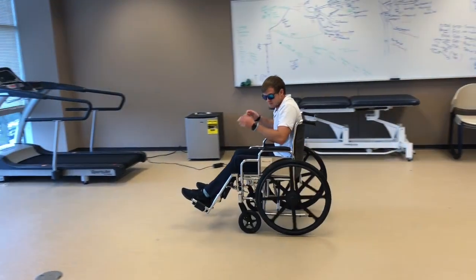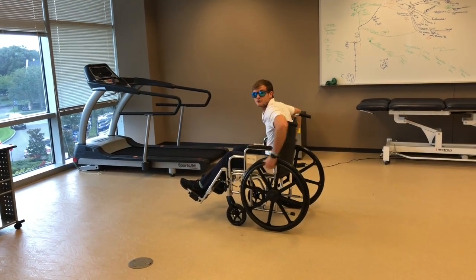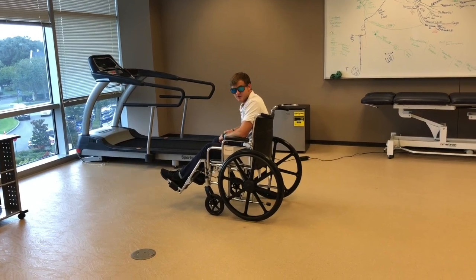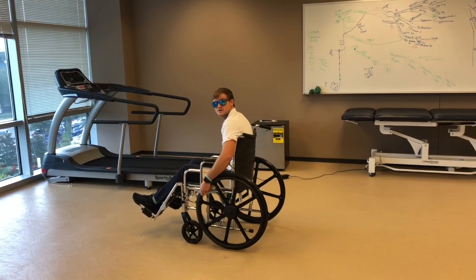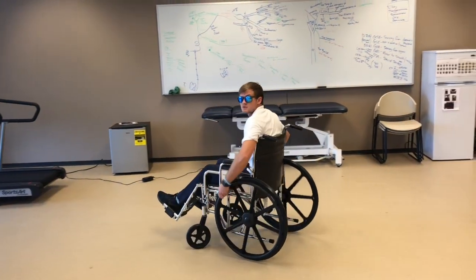So it's 10 to 2, with a nice, long, smooth stroke. If you do short, small strokes, you're not going to go very far — you just don't have the momentum for it. Now to go backwards, it's pretty much the reverse process. You're going to start at 2, go to 10, with a nice, long, smooth stroke, and that's what causes you to go backwards.